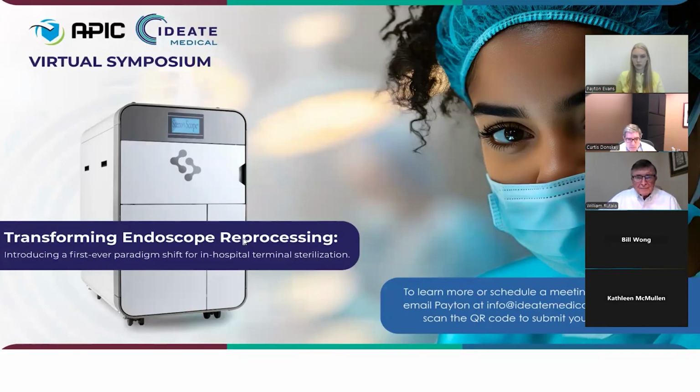So just to be very candid, one of the things we wanted to do was actually test more with used endoscopes, because that's really what's happening in industry, right? Everybody has used devices. So most of our testing, even our material compatibility testing and our life testing, was done with used endoscopes. Obviously, as we transition and work with the key MDMs, they're supplying us with new endoscopes to test. So for us, that's a pleasant change.